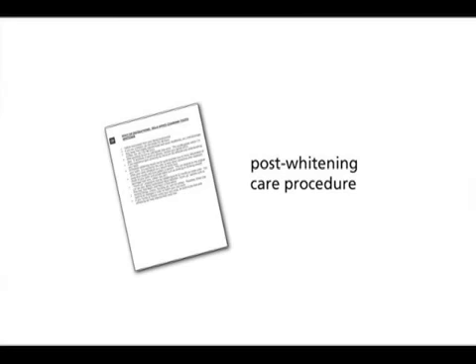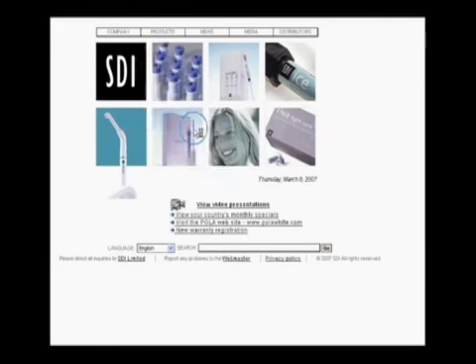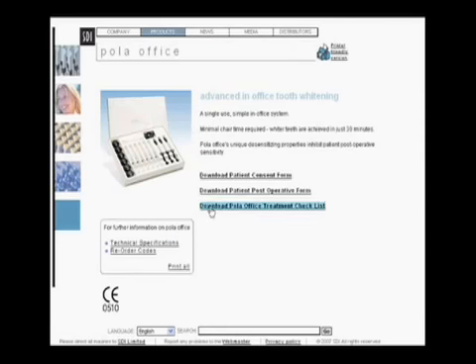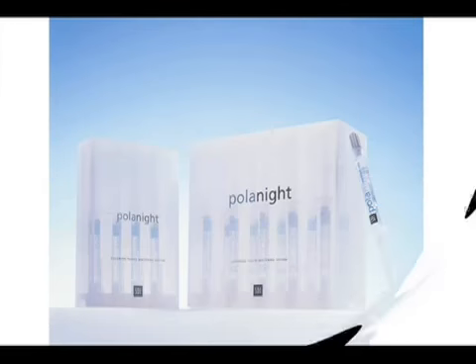It is important that you discuss with your patient the post-whitening care procedure, which can be found on the SDI website www.sdi.com.au and is located under the Tooth Whitening Pola Office tab in the Products menu. You may choose to dispense a desensitizing gel such as Soothe to minimize any post-whitening sensitivity.